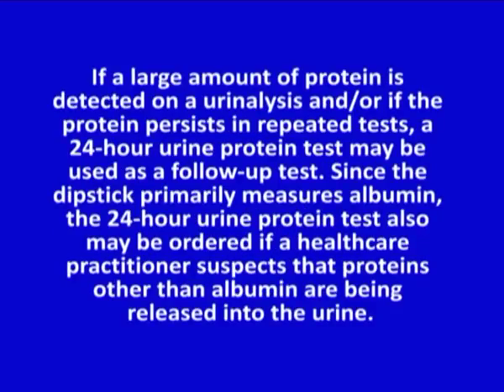If a large amount of protein is detected on a urinalysis and/or if the protein persists in repeated tests, a 24-hour urine protein test may be used as a follow-up test. Since the dipstick primarily measures albumin, the 24-hour urine protein test also may be ordered if a healthcare practitioner suspects that proteins other than albumin are being released into the urine.